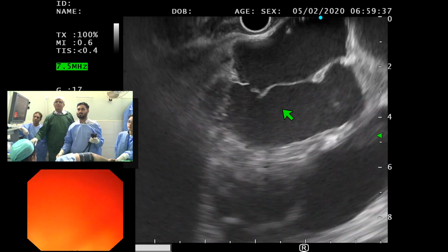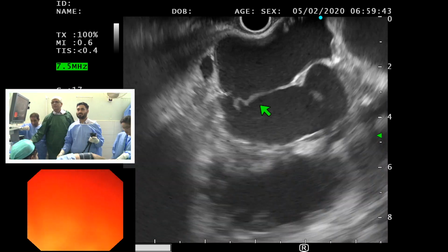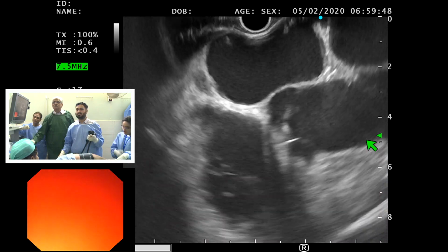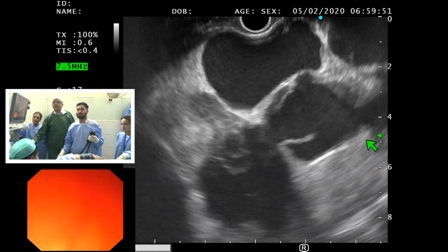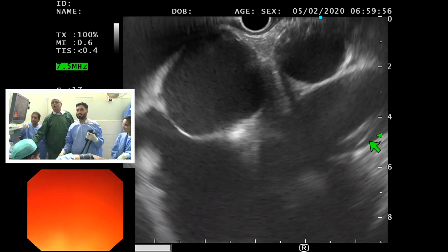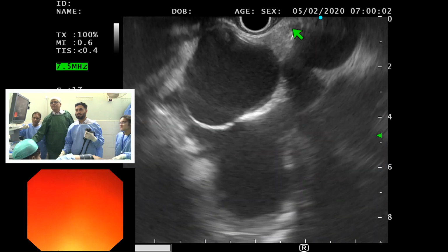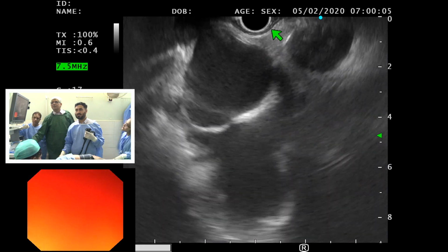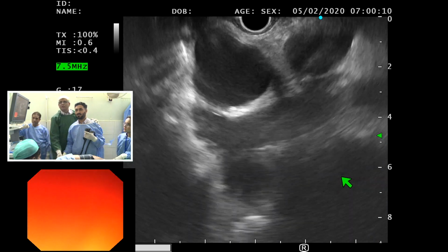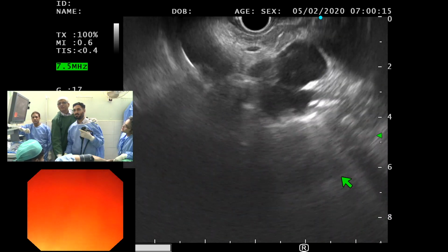Yeah, you've got the left atrium, pull back. So you've got both the valves. You can see mitral valve, you can see aortic valve. You can follow aorta if you want to, but there is no need to. So just pull back, and tip up, pull back, slight clockwise rotation, slight clockwise, that's it. So you have left atrium here, you have aorta here, and you have the subcarina, okay? And so you can look at the subcarina. So the way you look at it is you can rotate a little, so you will be able to see a little better there. You can see the lymph node, which we were not seeing before.